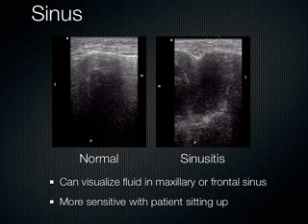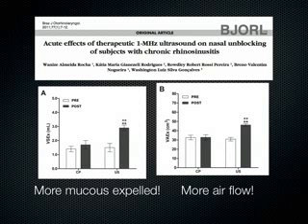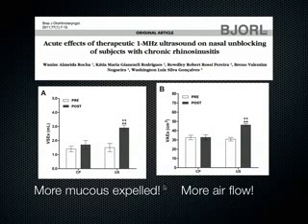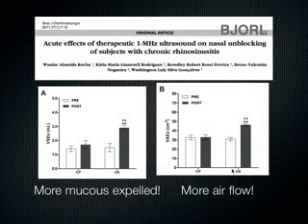It's easier to do this when the patient's sitting up. And actually, there are some therapeutic effects of low-frequency ultrasound on nasal unblocking in patients who have chronic sinusitis. With ultrasound, there's more mucus being expelled, and there's also more airflow after the patient gets ultrasound of their sinus. I don't know how accurate this is. It was published somewhat recently, in 2011.